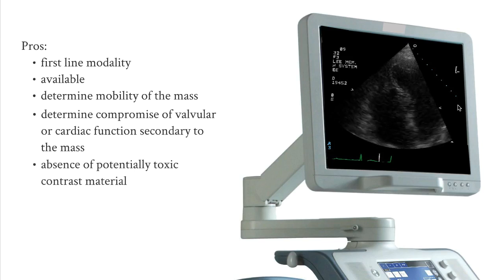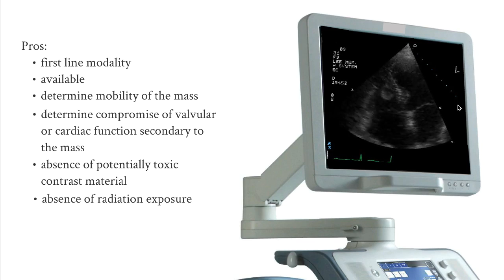There's also no potentially toxic contrast material that's used with echo. We don't routinely use it, but for cardiac masses and filling defects, it's helpful to use an echogenic contrast to sort of outline the mass from the wall. Typically, that's done with agitated saline. There's no radiation exposure. Echo is just ultrasound, and ultrasound doesn't cause any damage at diagnostic levels.